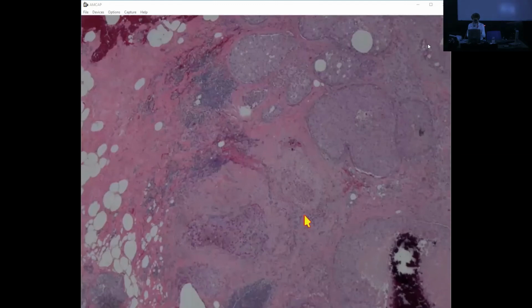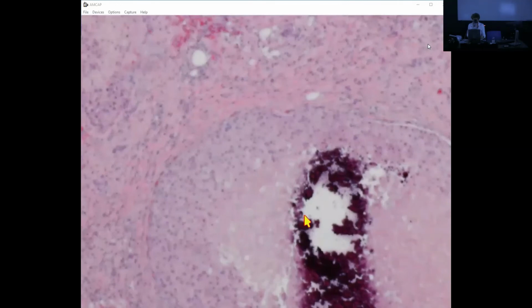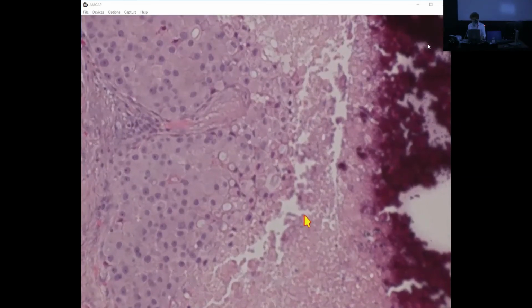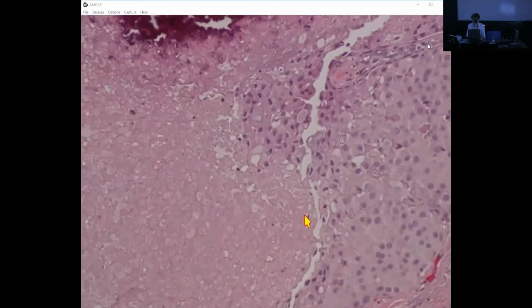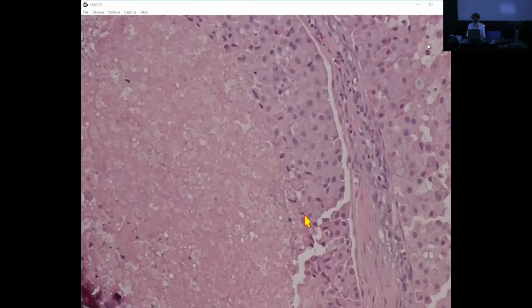Now, I want to point out one thing here: when the tumor cells necrose in these cases, generally they fall apart more like round cells. I don't know if you agree with me. At the interface with the area of necrosis, the cells seem to round up and then fall down, they die as round, almost single cells. There is almost an irregular outline in these cases, right?